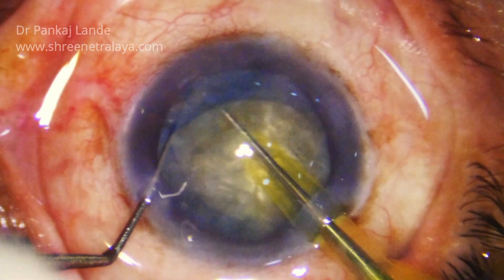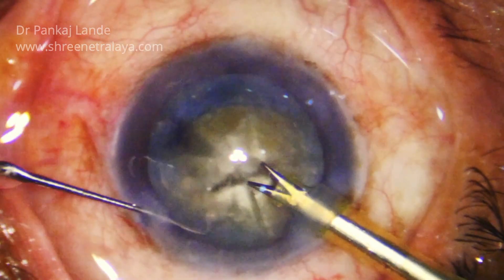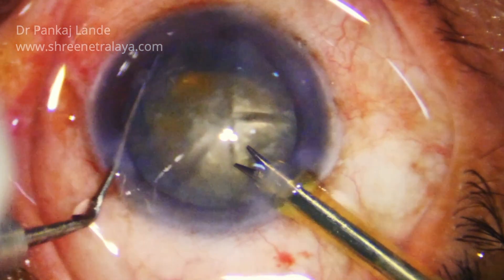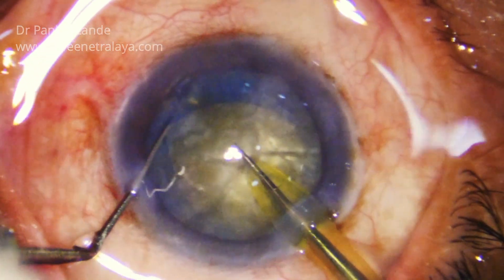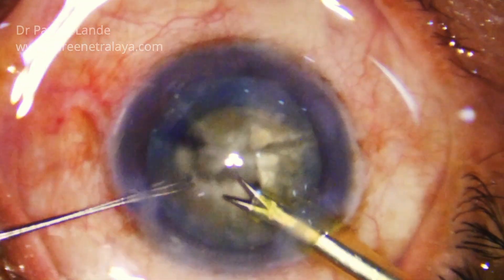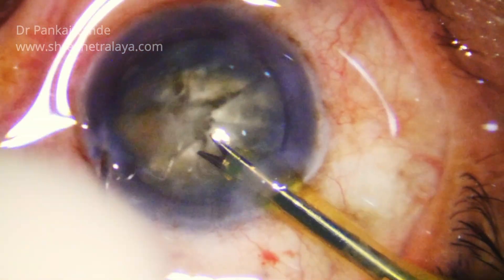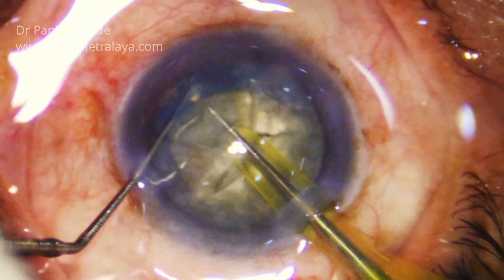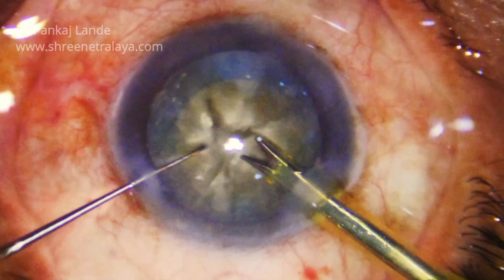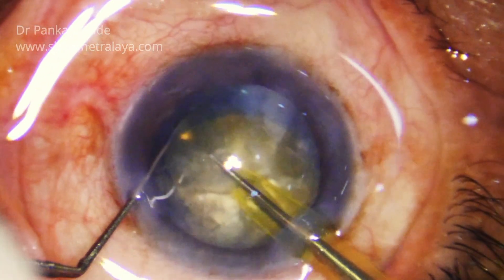The beauty of this technique is you can divide the nucleus not only into four pieces but more than four pieces — up to eight — very easily. The time duration taken for the surgery is definitely increased by nearly two to two and a half minutes for me, but it is worth it in cases of hard cataract where the safety is more important than two minutes extra. You can see I have divided the nucleus into eight pieces quite comfortably.